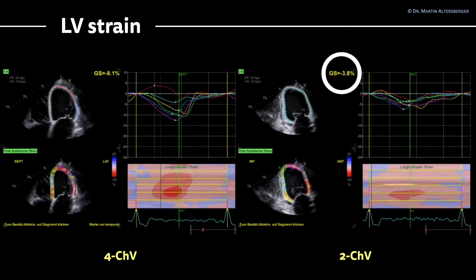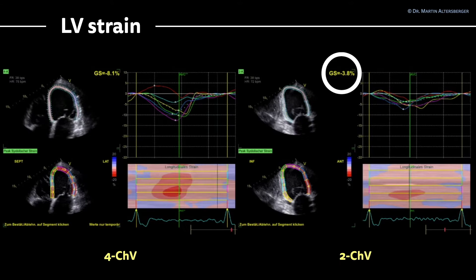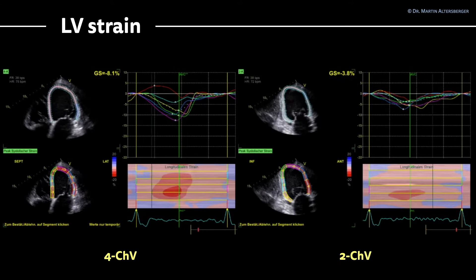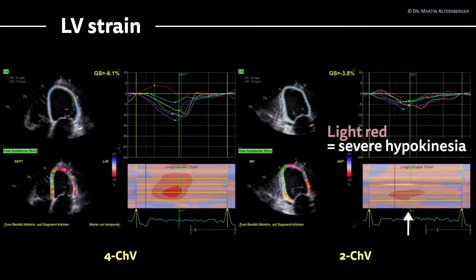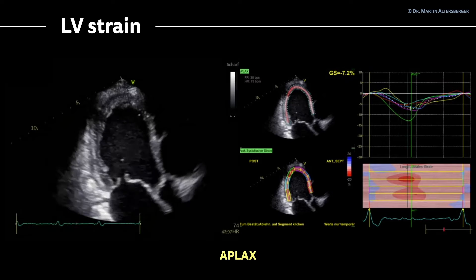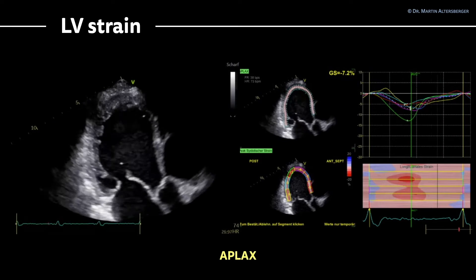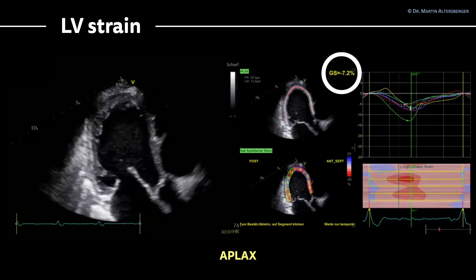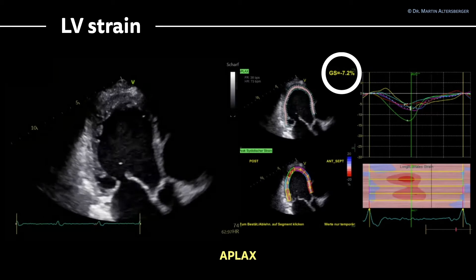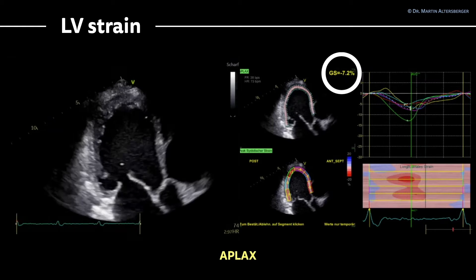In the 2-chamber view, we see a global strain of minus 3.8%, which is also severely reduced. We see the light red color in the strain M-mode, with not even a tiny bit of darker red color. In the apical long axis view, the global strain is minus 7.2% — again a severely reduced left ventricular strain imaging, with some areas slightly darker red in the color M-mode.